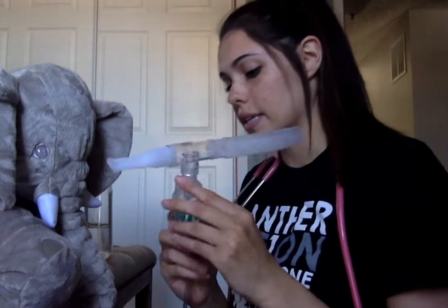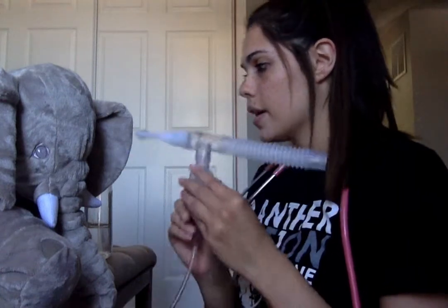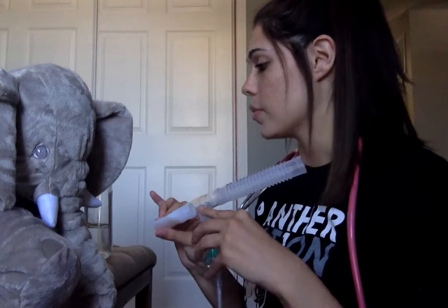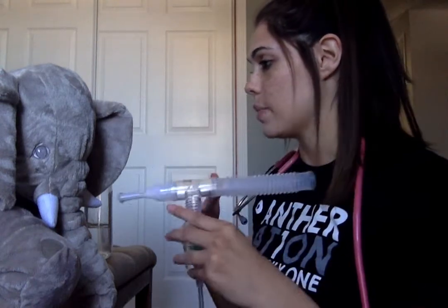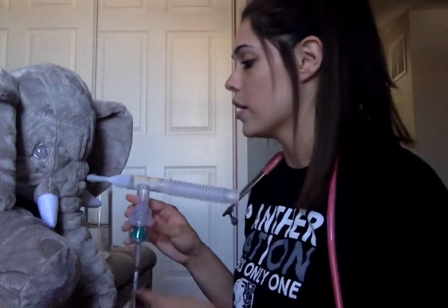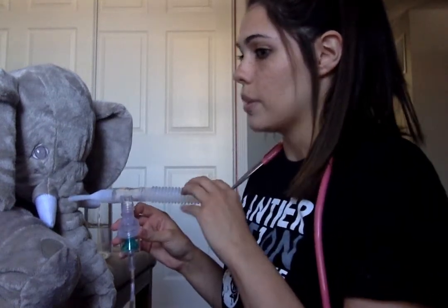Alrighty, so with this small volume nebulizer, your medicine is here in this little cup, and it's going to start misting. And what you're going to do is seal your lips around this mouthpiece and breathe as you normally would, taking occasional deep breaths until it stops misting. That means the medication is gone. So we're going to do the treatment now.